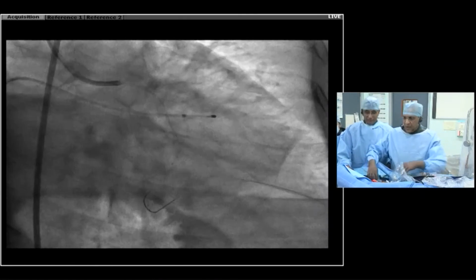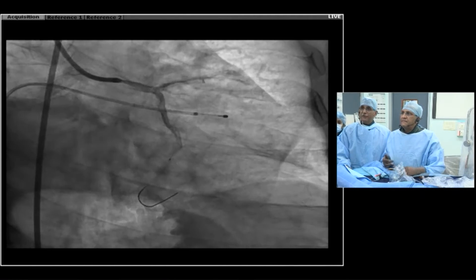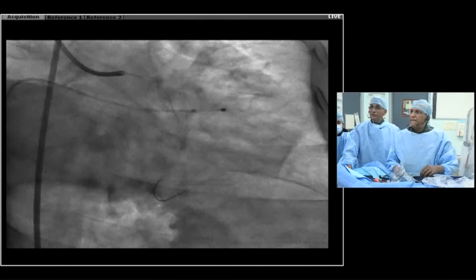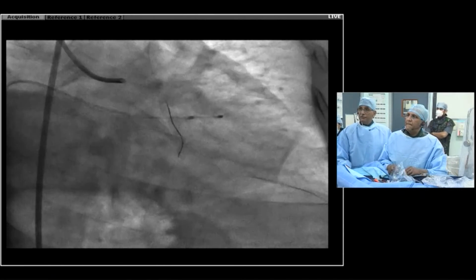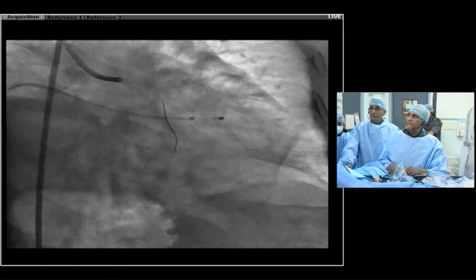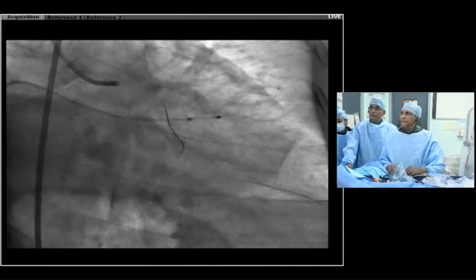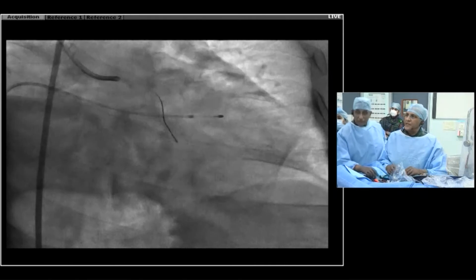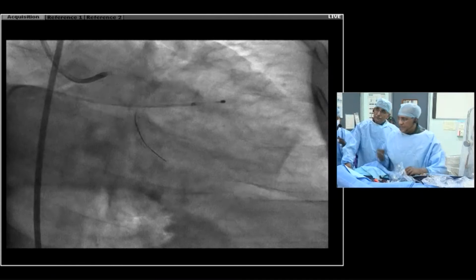I've got my microcatheter below now. Can you see? Yeah, yeah. Yep. Another option will be to use a double lumen microcatheter, which will probably be very helpful in this situation. No, I think I should be okay. You should be, yeah, just come back a little bit with it and then just a super massive bend. This is one where oftentimes if you shape it with the tip of the wire introducer, it's fine. Yeah, if you shape it with the tip of the wire introducer with sort of a double bend, like a JL, that would work.